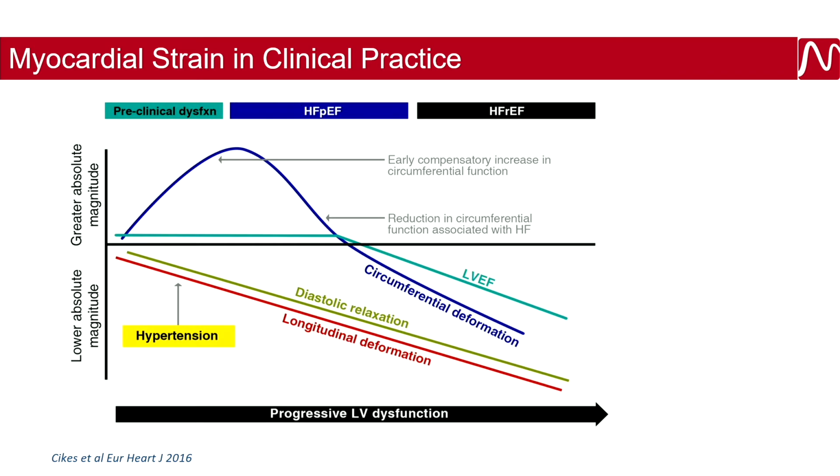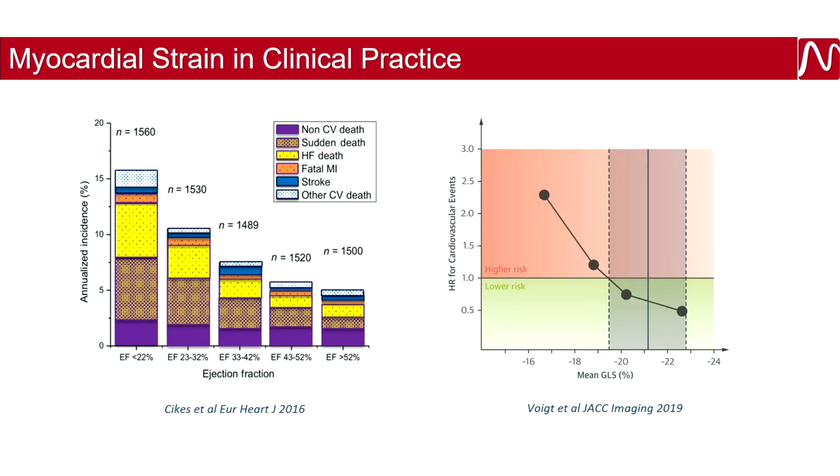But there might be already myocardial signatures and differences upstream that one can detect, not by ejection fraction, but rather by this diastolic relaxation, or even by abnormalities in the longitudinal strain, which are the layers that are the most vulnerable over the period of time.